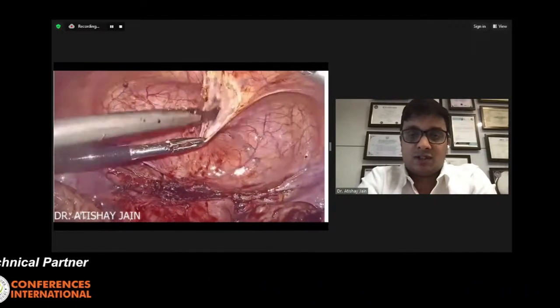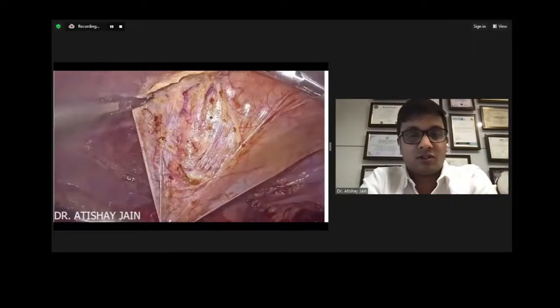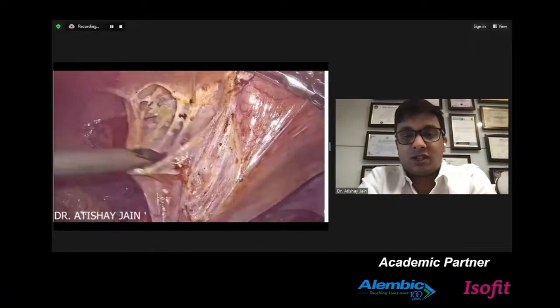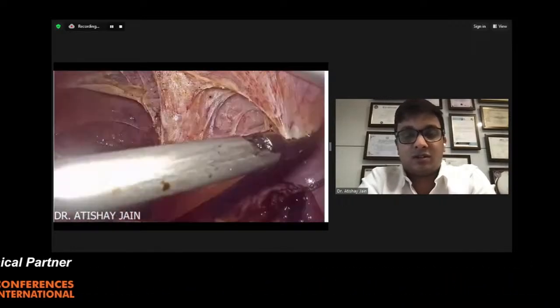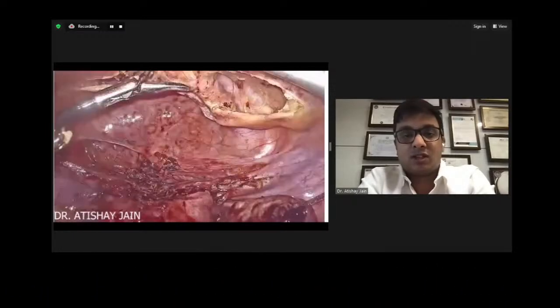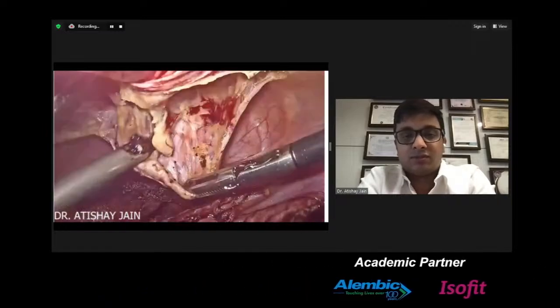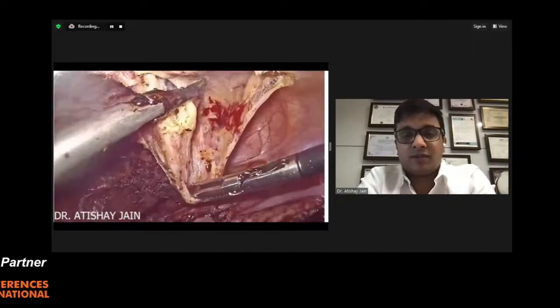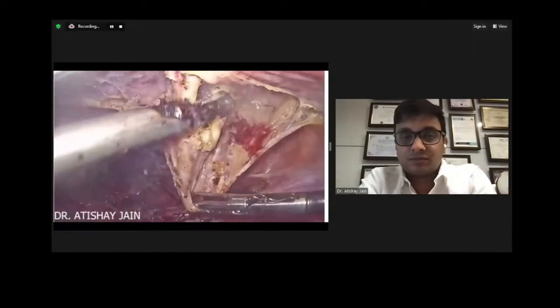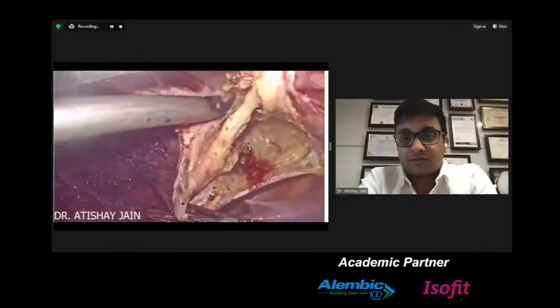The space of Retzius is opened up most commonly in cases of stress urinary incontinence when you're going for a Burch, and whenever you need to dissect a nodule on the bladder, or to reduce the pressure over it for a tension-free anastomosis, or in a case of fistulas involving the bladder, where reimplantation is required. And here we just see the boundaries of the bladder and cut above it.